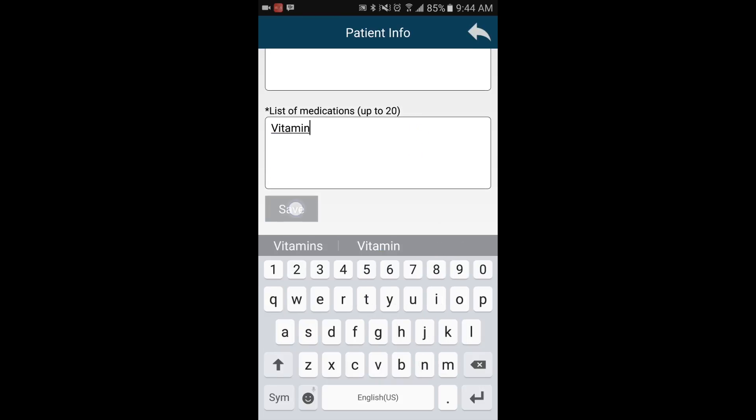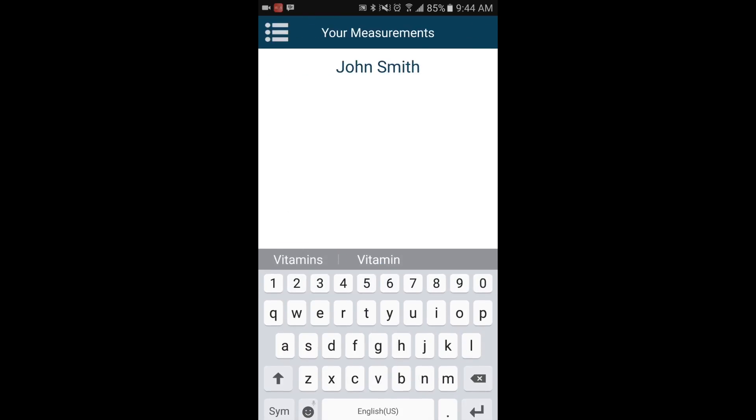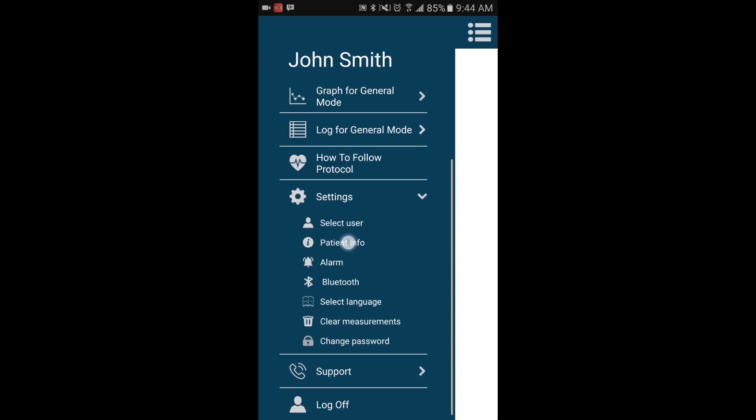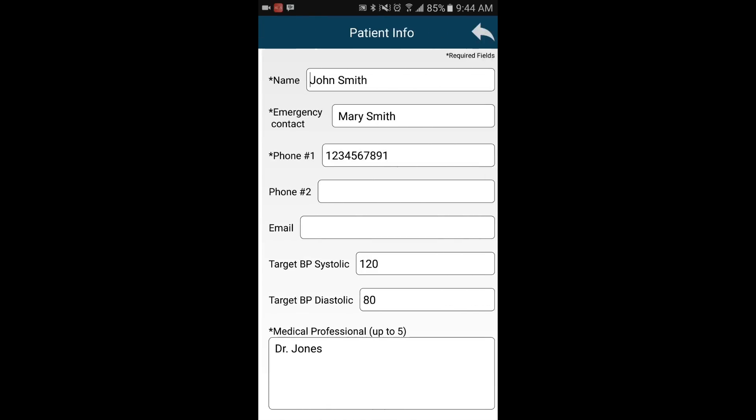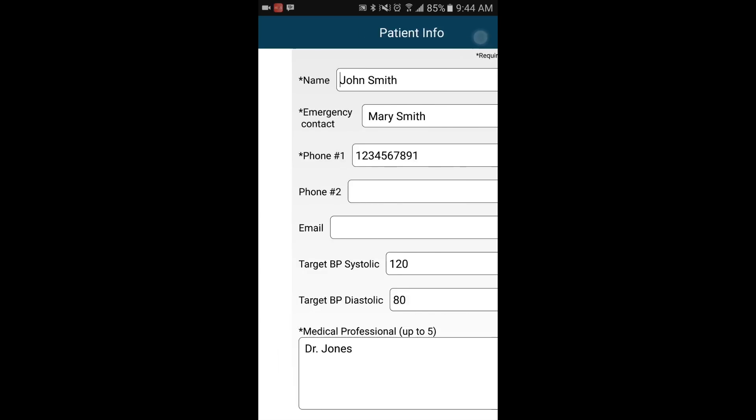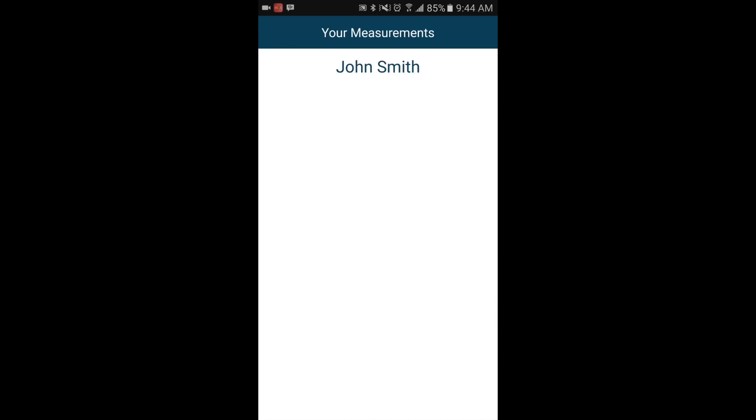Once you have entered all the information required, you will notice that the username at the top of the home screen will update to the one you had entered.